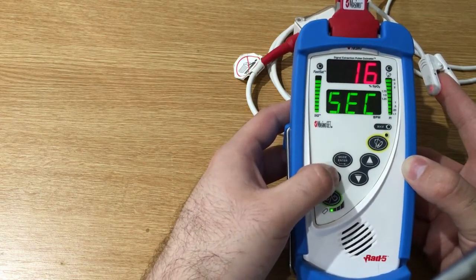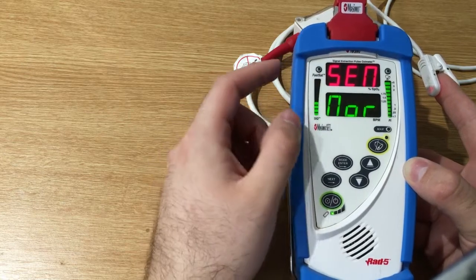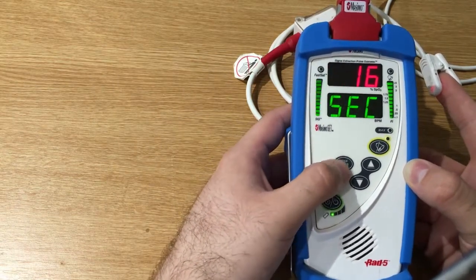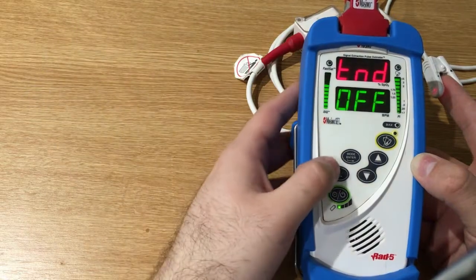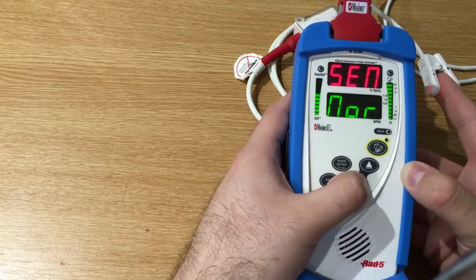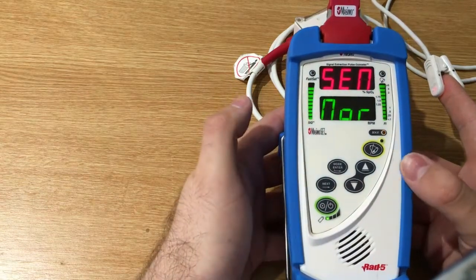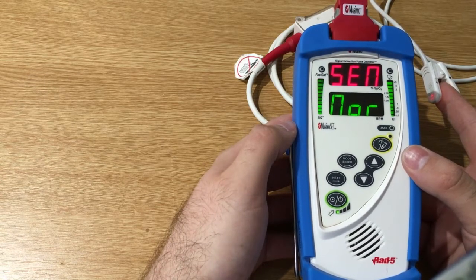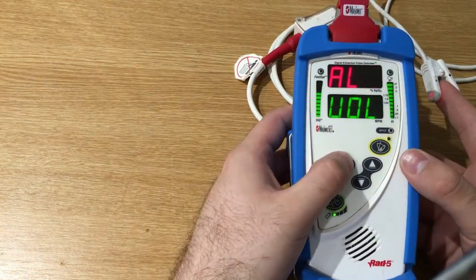So here we have other sub-menus as well. We can select the sensitivity, and we have the three sensitivity modes that we have in the Radical 7 as well. We have the normal, that's something in between the maximum and the APOD. So in this menu we have the APOD, the normal, and the high. The APOD is the Adaptive Probe Off Detection, and this is the least sensitive in picking up a reading with low perfusion. The maximum is the best one, and the normal one is a combination between the two.